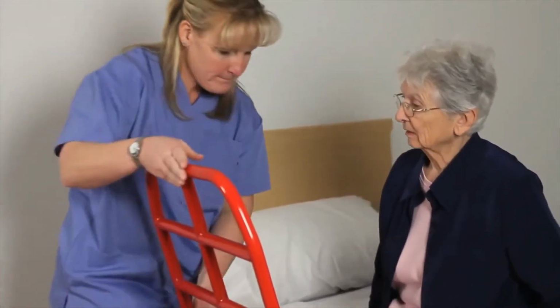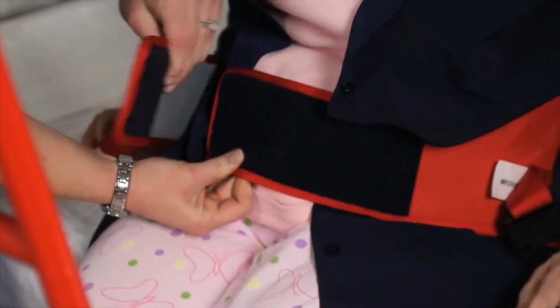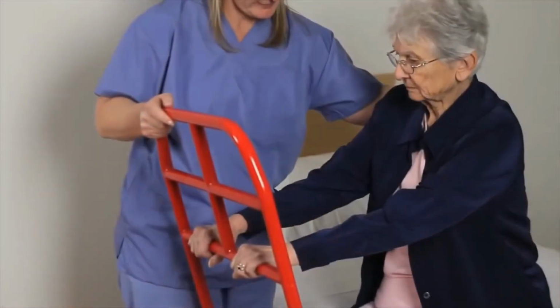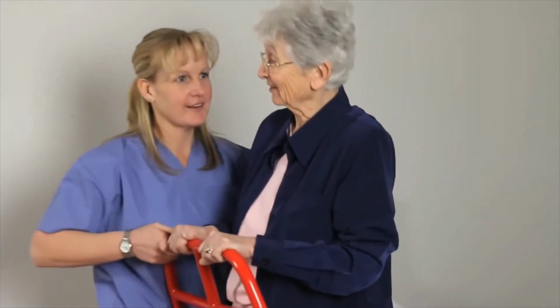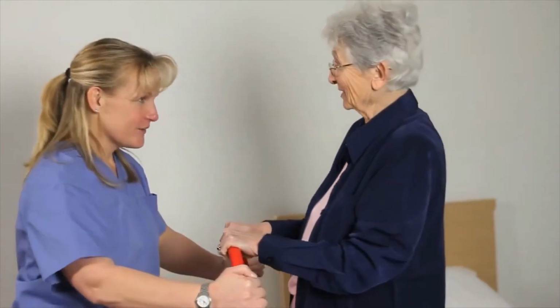When there is a risk that the patient might fall during the transfer, use a Return belt. If there is no risk, go ahead and use the Return without a Return belt. Now, ask the patient to find a comfortable grip using the vertical and horizontal handles provided to pull themselves up. When the patient has a good standing position, transfer them to the commode and let them sit down.